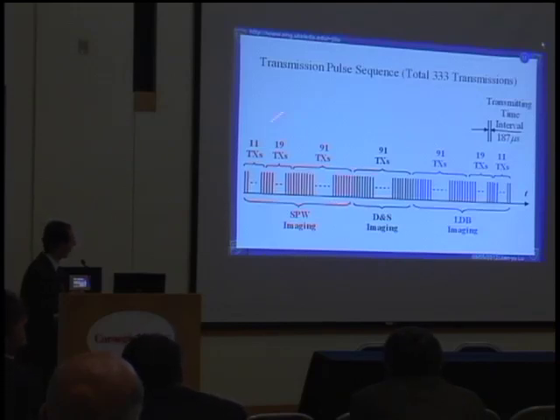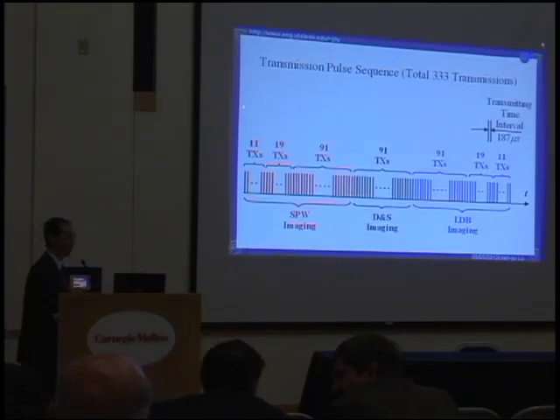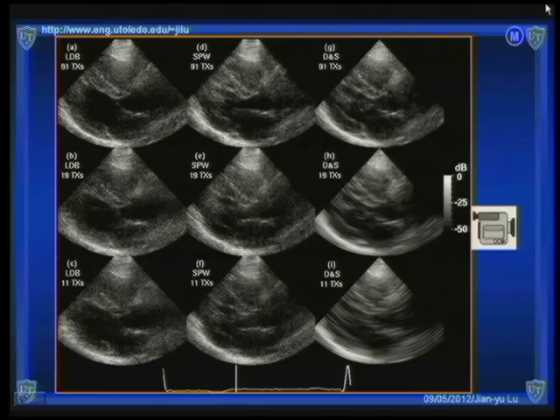So in this way, we'll be able to do comparison for the same image section and almost the same moment of either heart or other organs, to compare image quality between different imaging methods. So here's a result you can see.